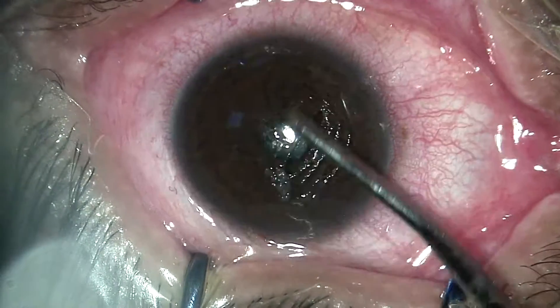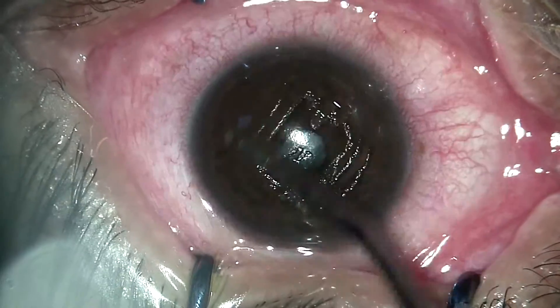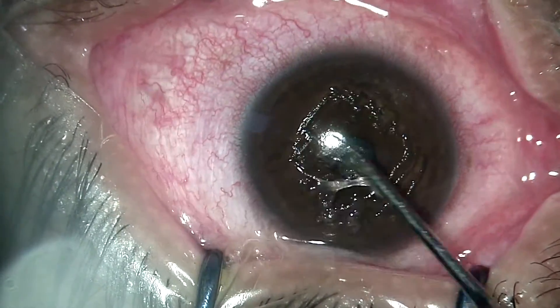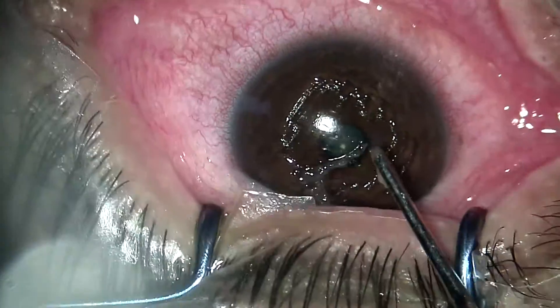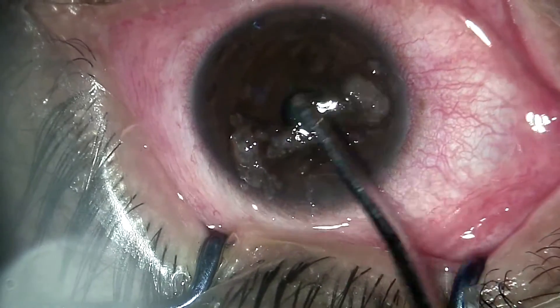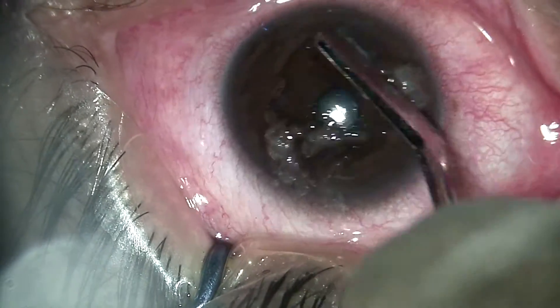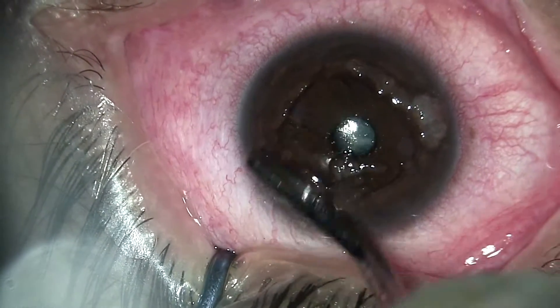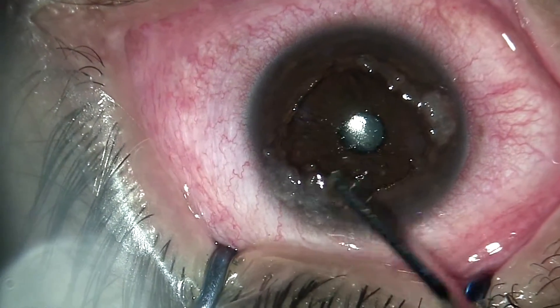This is another magnified view where we are removing the epithelium using a hockey stick. In collagen cross-linking, what we are essentially trying to do is to strengthen and make the cornea more rigid, so that the progressive thinning and the steep cone-shaped cornea stops its progression and becomes more regular.